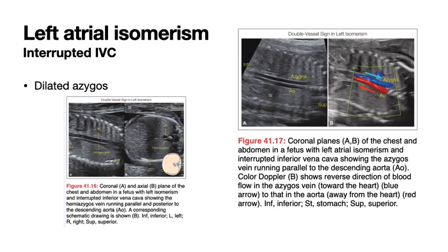And one of the things that kind of jumps out at you is the azygous and aorta basically sitting right next to each other or juxtaposed. So yeah, in the coronal plane, you'll see two vessels pretty well, maybe close to the same size. The aorta is usually bigger, but basically it looks like there's two aortas right next to each other, and that's not the way it's supposed to be.